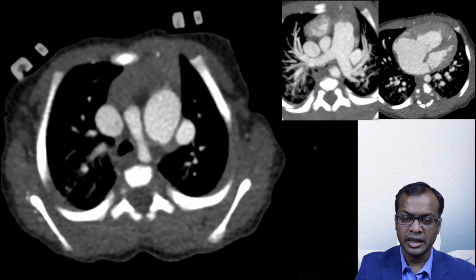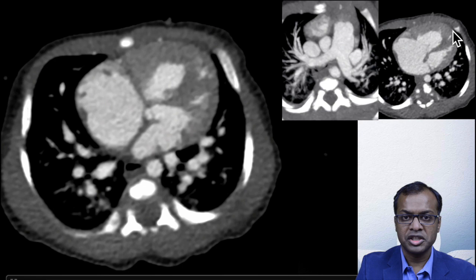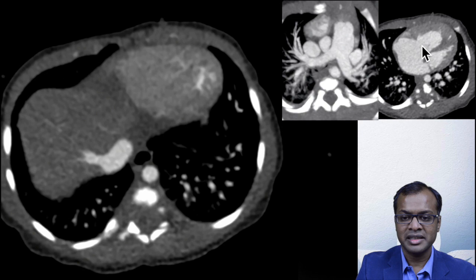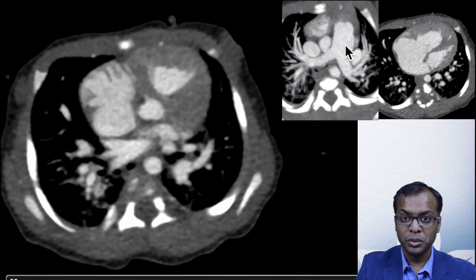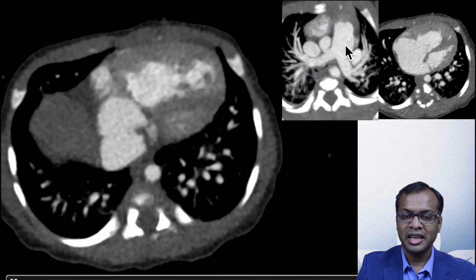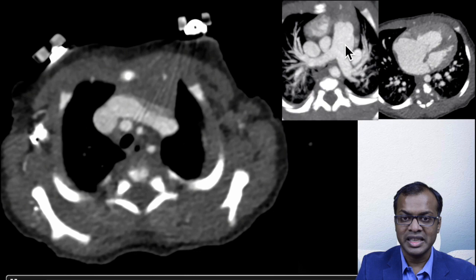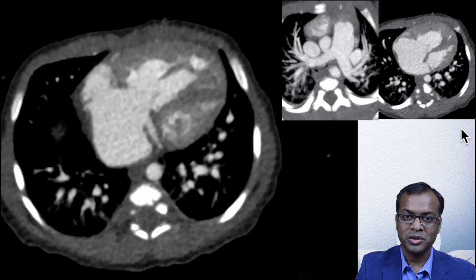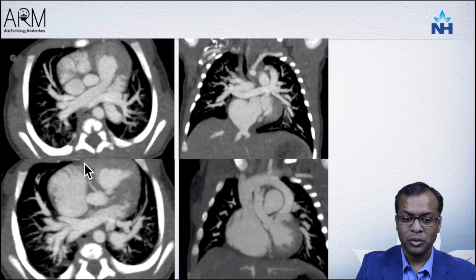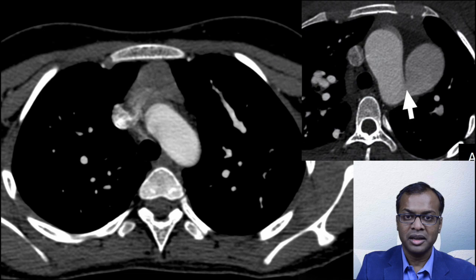Let us look at an interesting case. I have put the video in the center with representative images clearly showing right ventricular hypertrophy, RV dilatation, and grossly dilated pulmonary artery. Look for different etiologies — ASD, VSD, shunts, anomalous pulmonary venous connection — to decide what is the cause of pulmonary hypertension in this patient. When you see these specific images, the abnormal pulmonary venous drainage goes to the right side of the heart, leading to severe pulmonary hypertension in this patient.